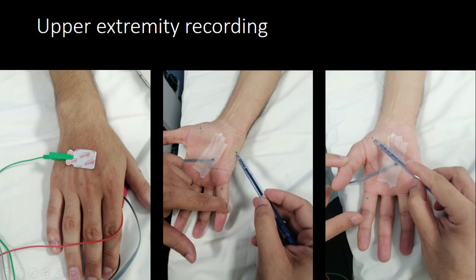When you're doing the hand, as I said, most of the commonly done nerve conduction studies are distal. Try to apply the ground on the back side so you don't have to flip it again and again every time you're doing the sensory and the motor, and the ulnar and the median. Once you get the ground on, it's going to stay there. It will save you a lot of time, believe it or not.